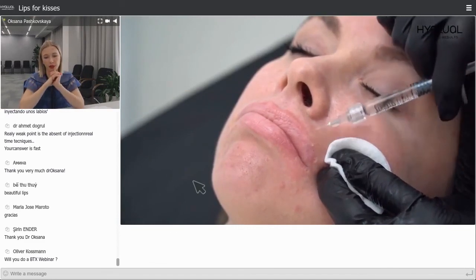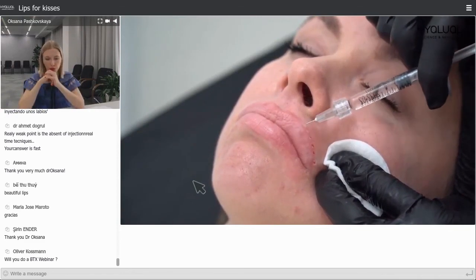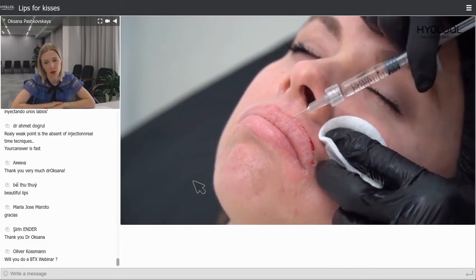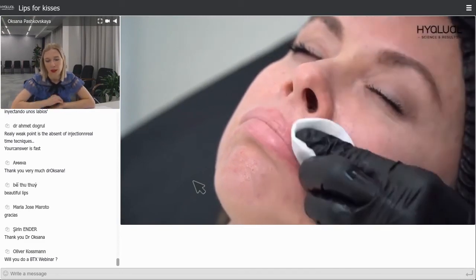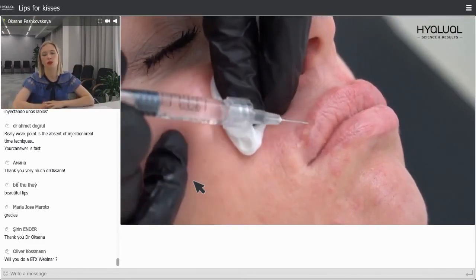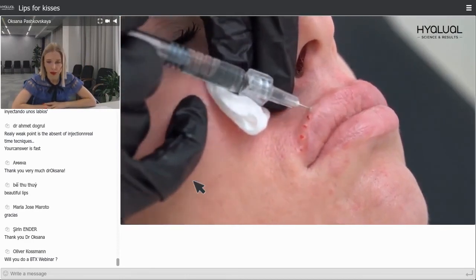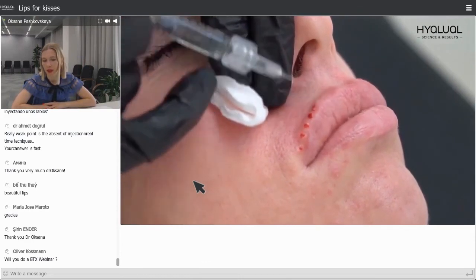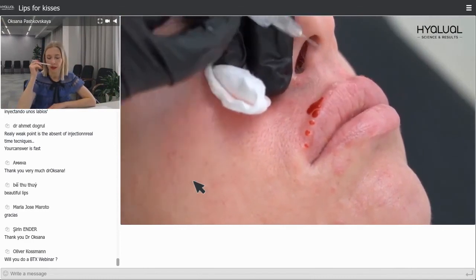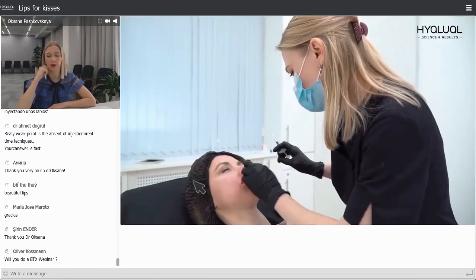This is the Parisian technique, vertical injections. You just inject superficially and mostly go to the closure line, as I mentioned before. So it's pretty easy. Stretch the lip with your left hand, because it would be easier for you to inject the lips. And you see the step is half a centimeter. I don't go further than the central Cupid's bow. Don't go there, you see.